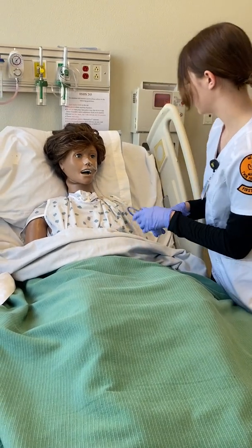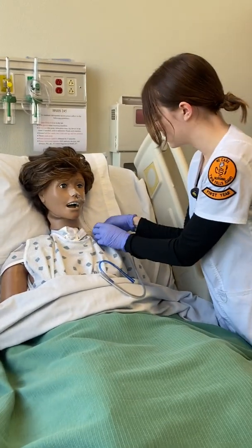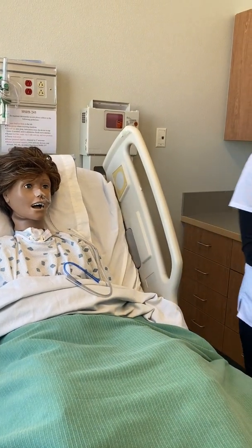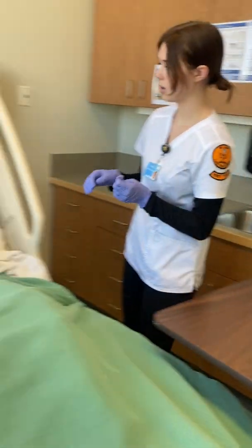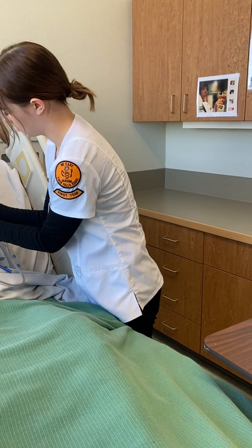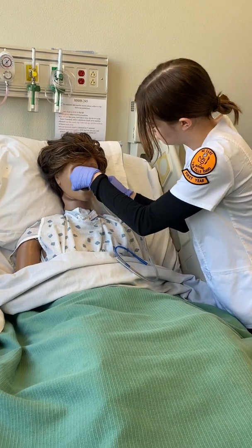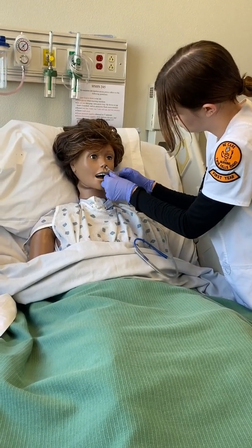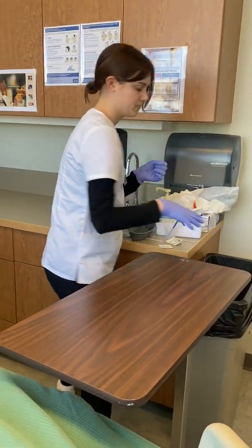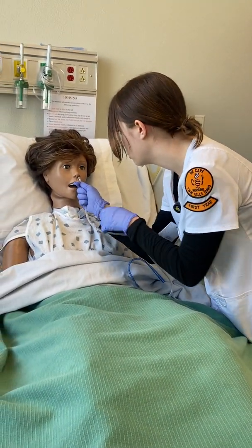All right, we're gonna go ahead and discontinue your tube now. I'm just gonna take our little adhesives off. It's gonna feel a little bit uncomfortable again because it's coming out this time. But I'm just gonna have you, before I take it out, take a deep breath in and hold it while I take that out. And I would be super careful taking off this adhesive just because it might be irritating to the patient's skin. All right, go ahead and take a deep breath for me, okay? We're gonna go ahead and take it out.